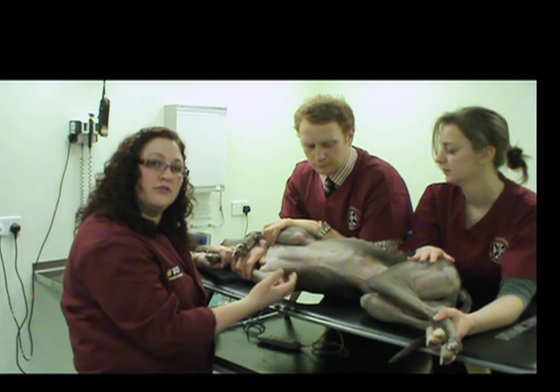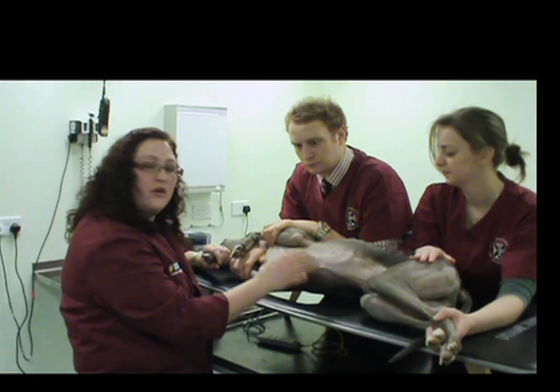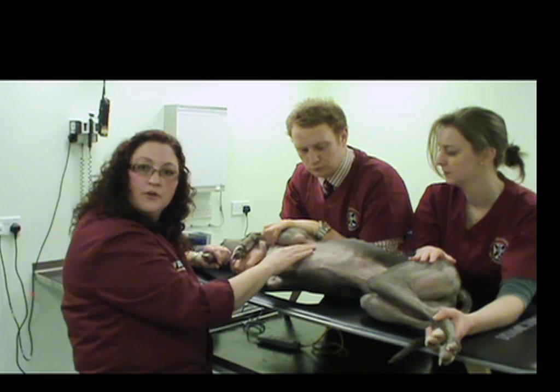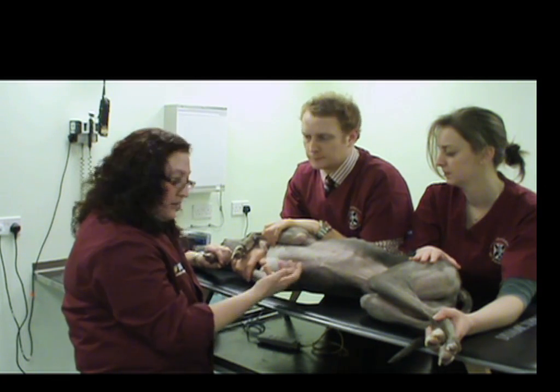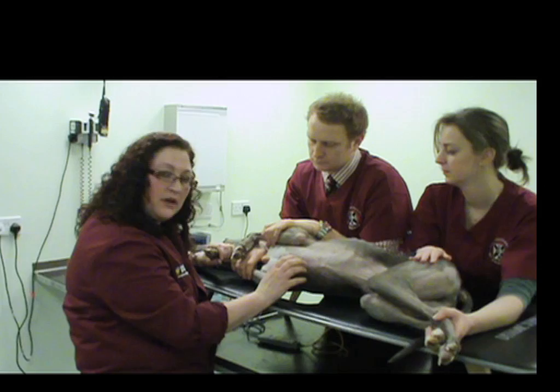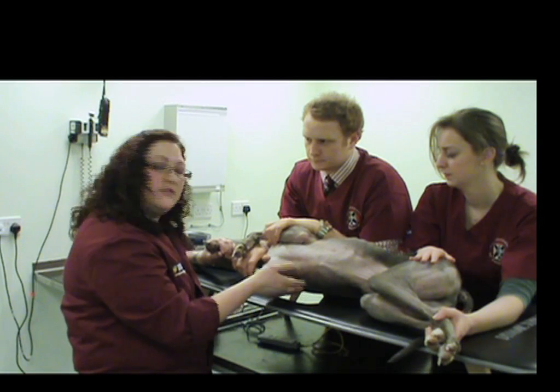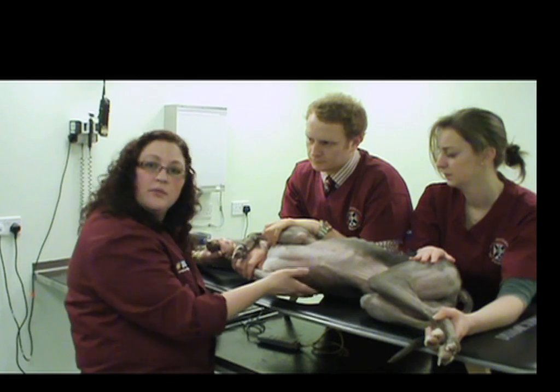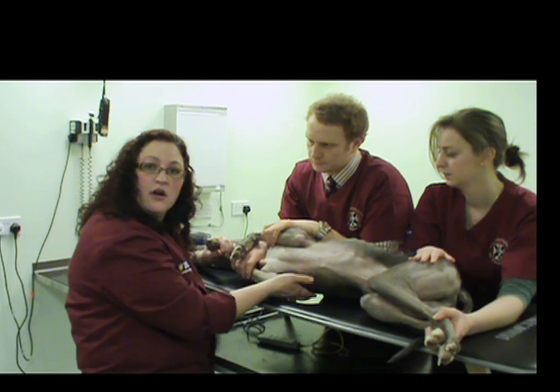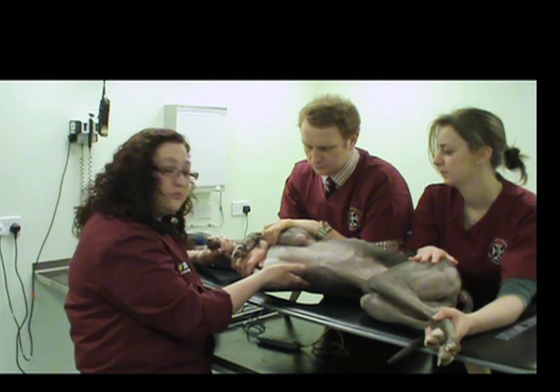Our patient is in right lateral recumbency because we'll be looking primarily at right-sided views. There are other views — subcostal views from a more abdominal approach, and also from the left side — however, the right-sided views will give us a lot of information. The left-sided views are very useful for performing Doppler studies, but we won't be covering that today. Having the patient in right lateral recumbency also means the dependent lung will not be as aerated as the non-dependent lung, giving us a good window as the heart falls with gravity down into the cardiac notch and into more contact with the thoracic wall.